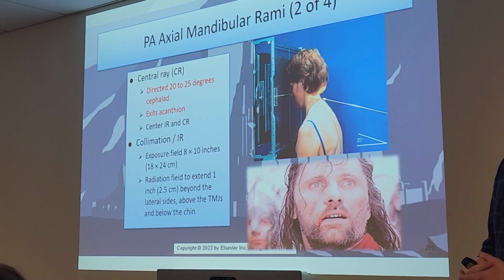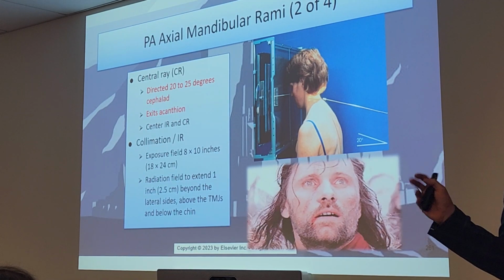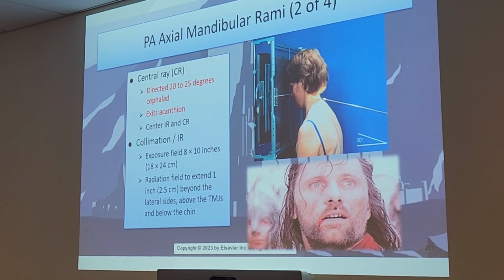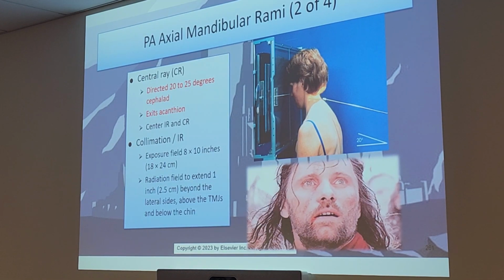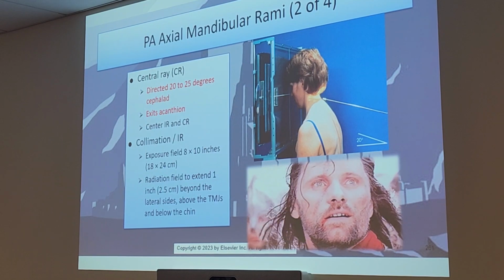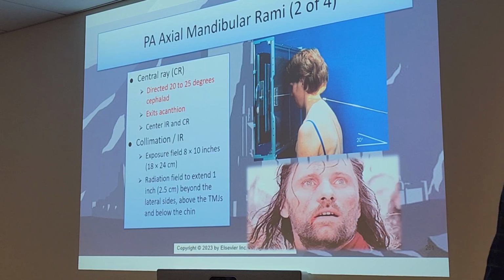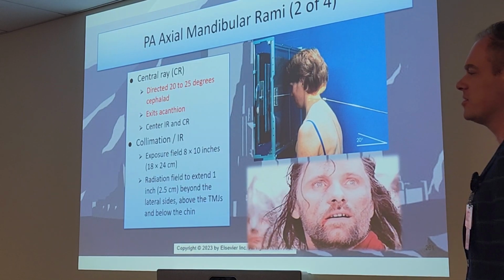SID is 40, right? Everything we're doing this chapter is 40. Nothing is 72. Yes. Everything, suspend respiration. Stop breathing. We're not holding, we're not blowing out, we're just suspending. Stopping.